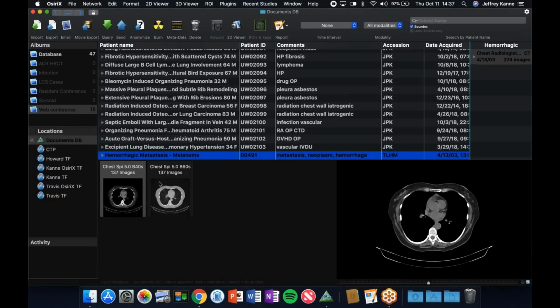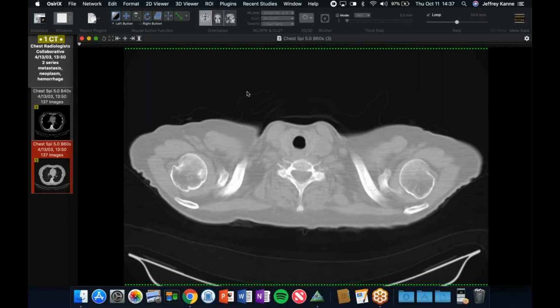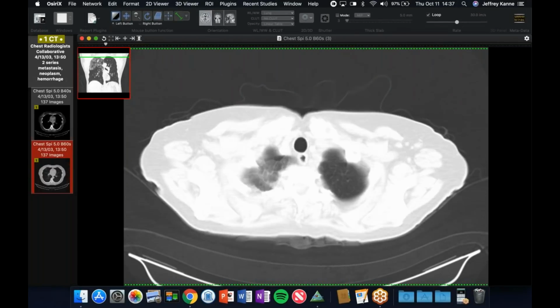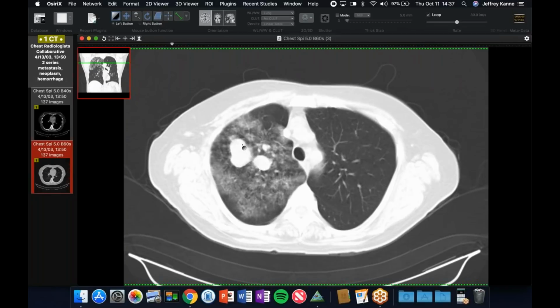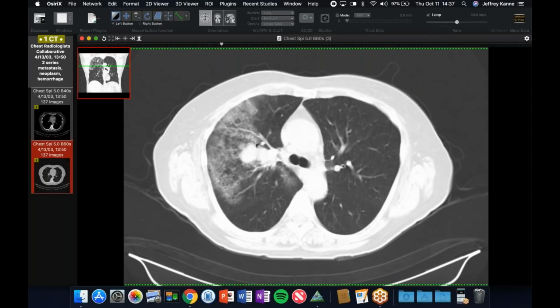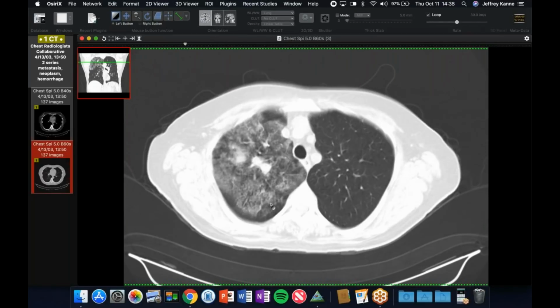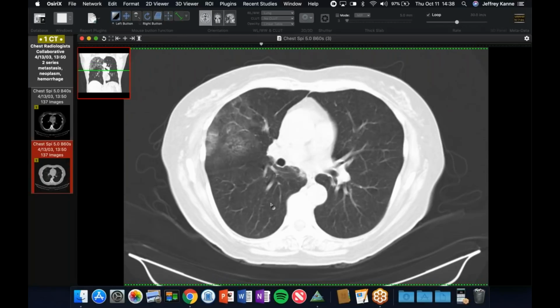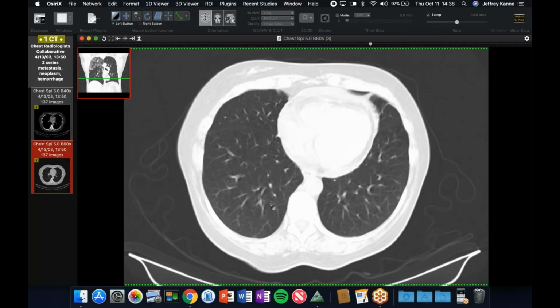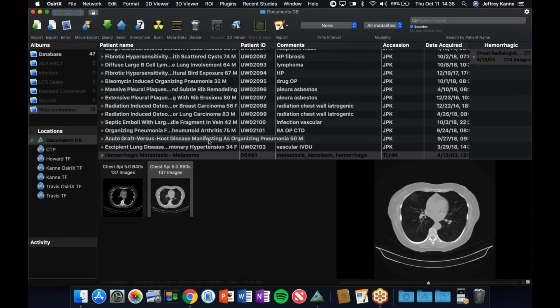This was a case that Tan, Lucy, and Muhammad sent a while ago. This is melanoma with metastasis, that are metastatic, but I'm sorry, that was redundant. But it's hemorrhagic. This one actually presented with hemoptysis and has hemorrhage. So you can see there's this large mass in the right upper lobe. It looks like it may be involving the artery because you can see the airway next to it. And then there's all this ground glass around it and kind of in the right territory. So I suspect that's a true hemorrhagic metastasis that actively was bleeding. And it's a non-con, so I don't know, but it's pretty dense in there. That was a melanoma, just while we're on the topic.